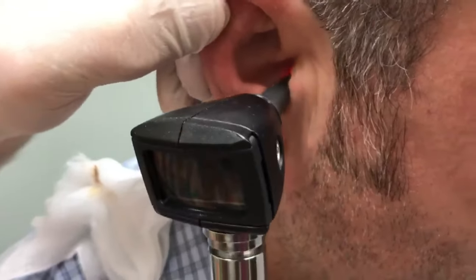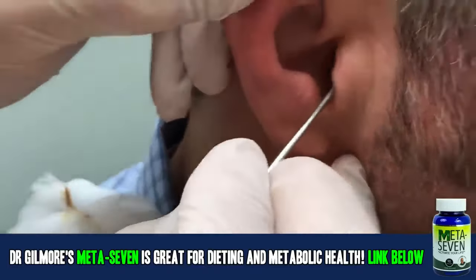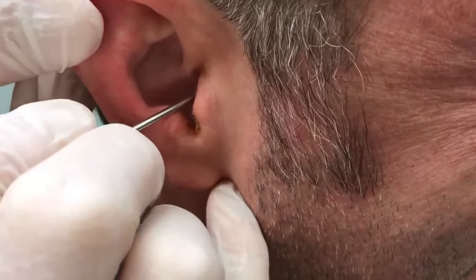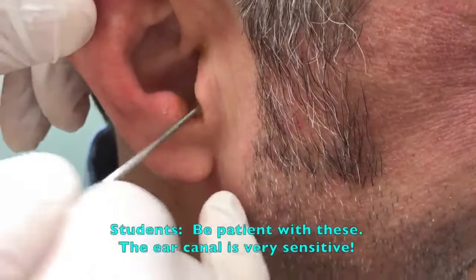You all right? You've been good. A little water in there. Now don't go anywhere. It should feel a little bit odd, but it shouldn't hurt. Yeah, you've still got a great deal in there. So we're going to try one more time right over here. Nice and slow. Oh my. That feels better.